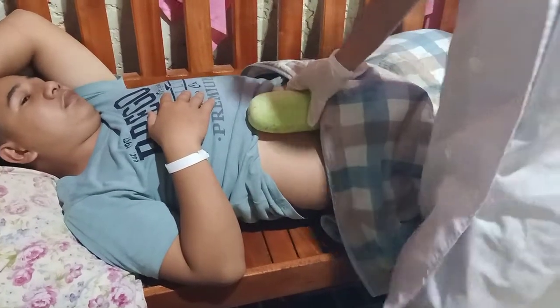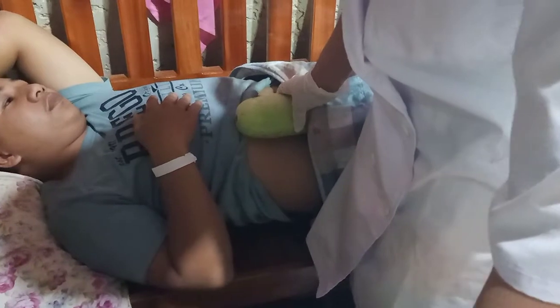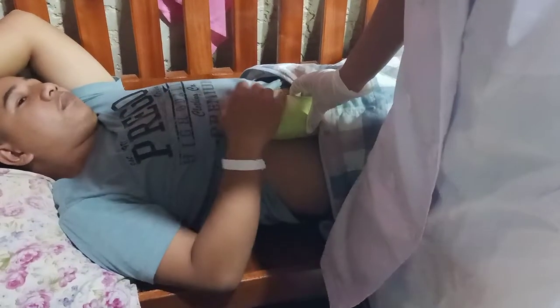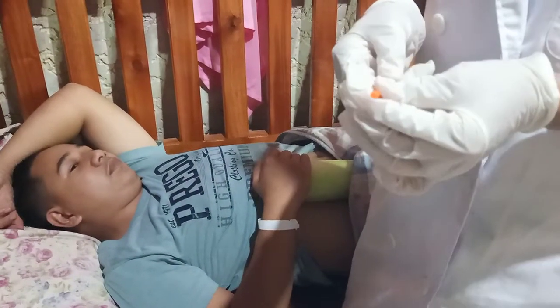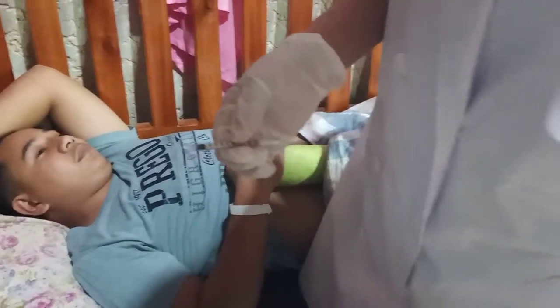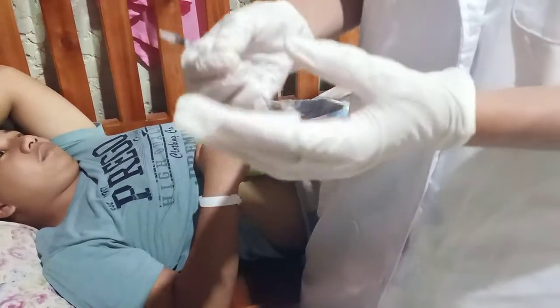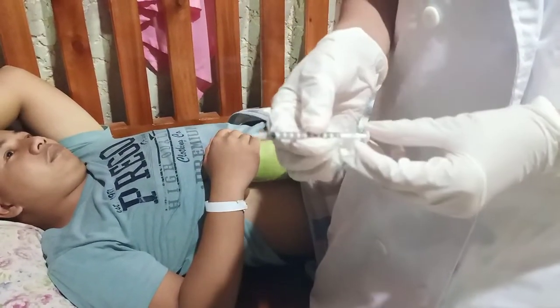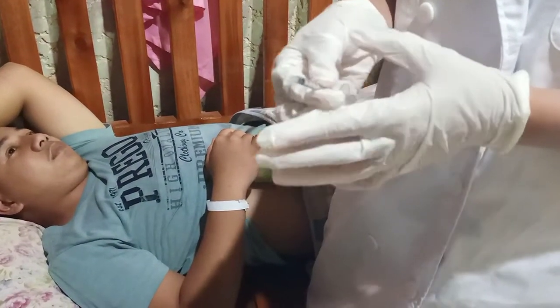And pull off the needle cap and hold the syringe between the thumb and the forefinger of your dominant hand, as if you're holding a dart.